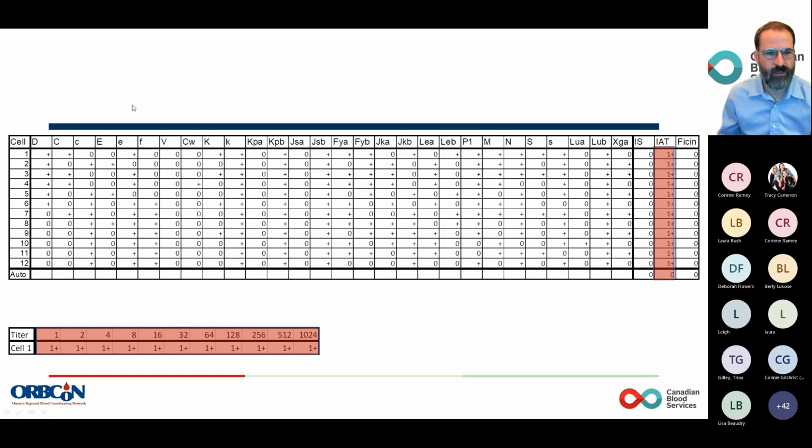So what's the approach to this one, or what are the key concepts here? We're seeing low reactivity, panagglutinin, so whatever it is is probably a high frequency antigen, and it's solid reactivity across the board. There's no variability really in the testing. This is a point against multiple alloantibodies, where we'd often be seeing 3+, 1+, 2+, 3+, some variability in strength. This looks like one and the same antibody reacting similarly with all of the cells being tested. So this argues against multiple alloantibodies and is probably more one antibody with one specificity.